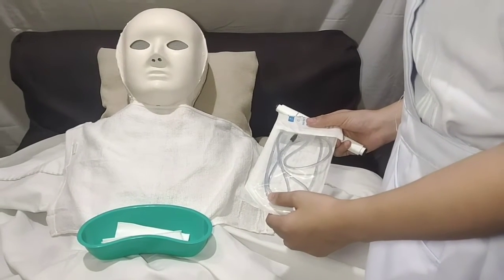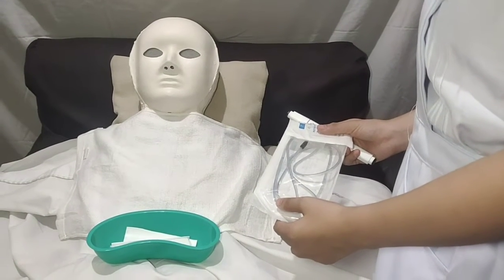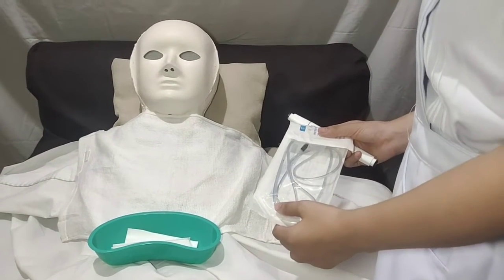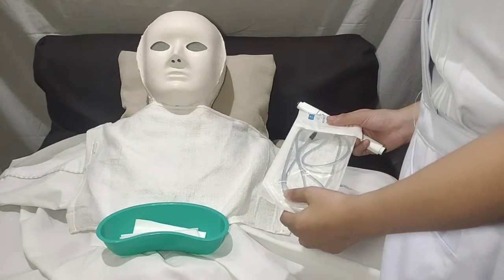Next is to measure the distance to insert the tube by placing the tip of the tube at the patient's nostril and extending to the tip of the earlobe, and then to the tip of the xiphoid process. Then, mark the tube with an indelible marker.